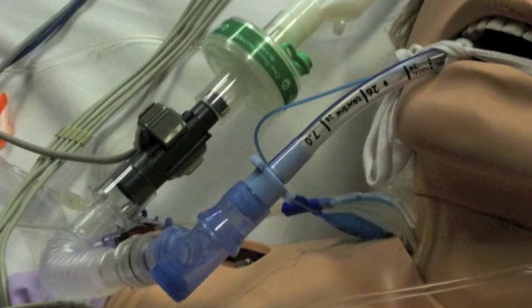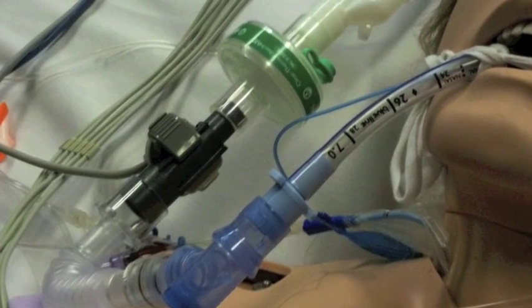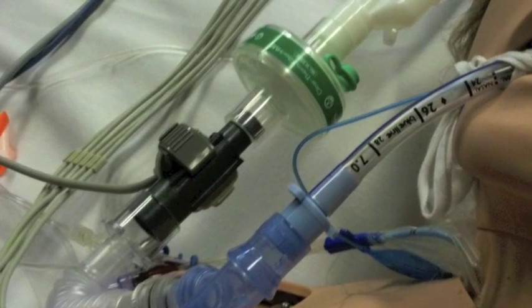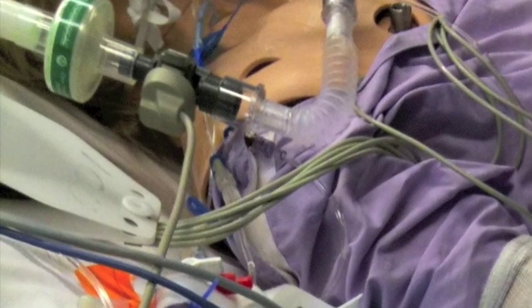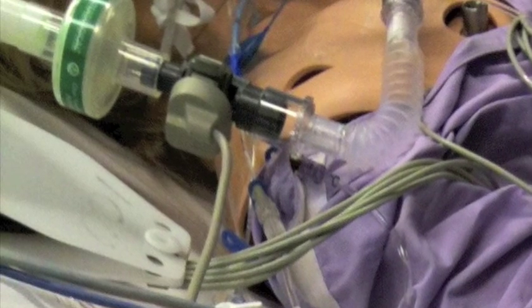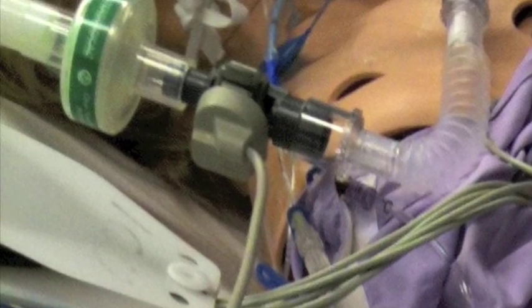The disadvantages of the former are that it causes a higher resistive load for the patient, can only be used in a closed system, increases dead space, and is bulky. However, it is more reliable and responsive to change than the side stream form, which can easily become obstructed with secretions after prolonged use.